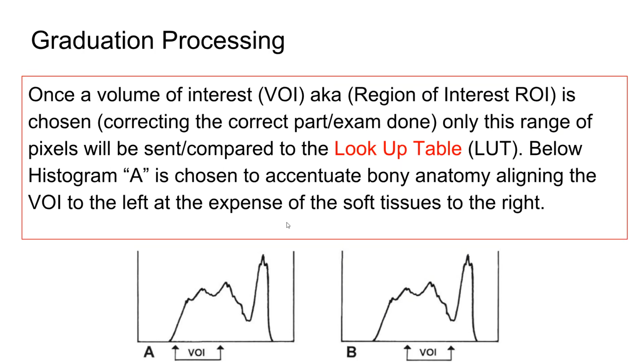Is that what we would call rescaling? It'll force the rescaling process to happen again. But rescaling happened before you ever did anything. Rescaling occurs when your data from your histogram is compared to the lookup table histogram. And then the lookup table histogram says, no, I think your scale of contrast should be this. I am going to rescale it.